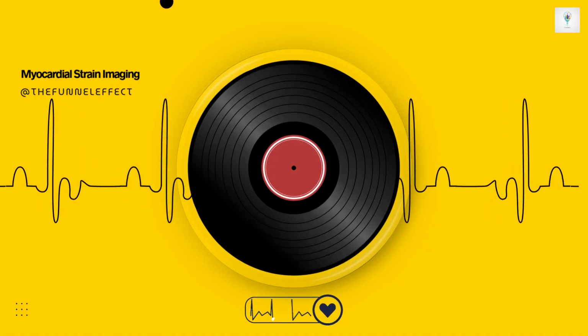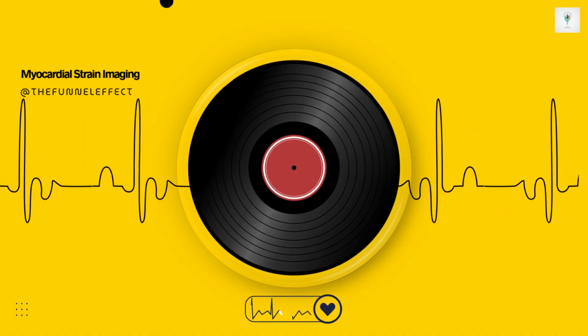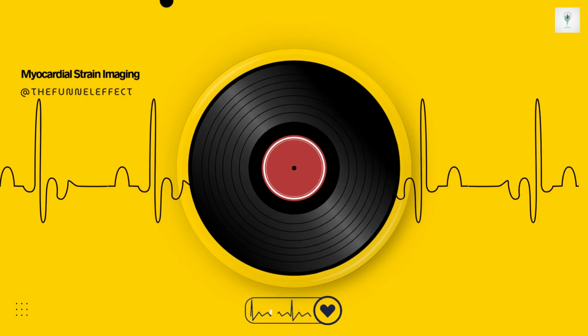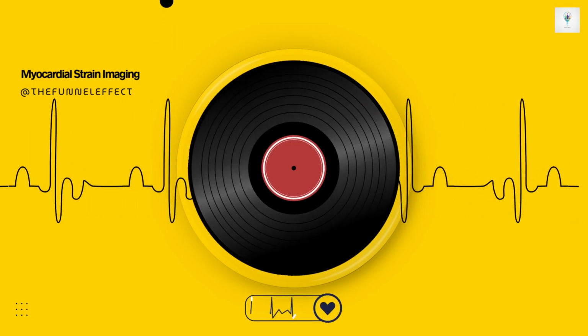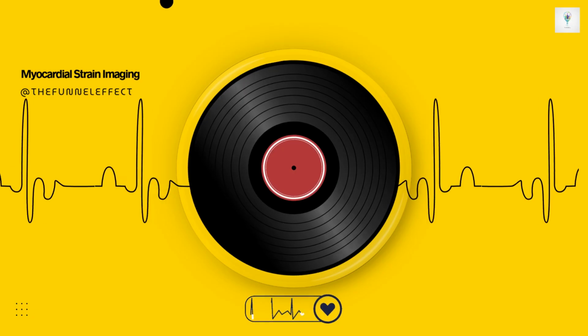I mean, the heart is this incredibly complex muscular pump, right? And strain imaging lets us access the fundamental function of the muscle fibers themselves, how well they shorten, thicken, and lengthen. And if you take away just one thing today, it should probably be this. The core clinical parameter that really drives nearly all modern diagnosis in this area is global longitudinal strain, or GLS.